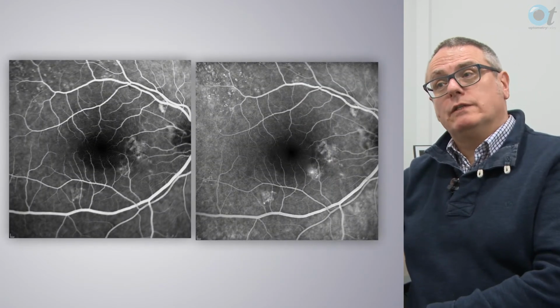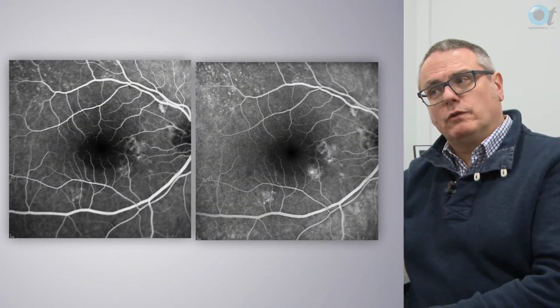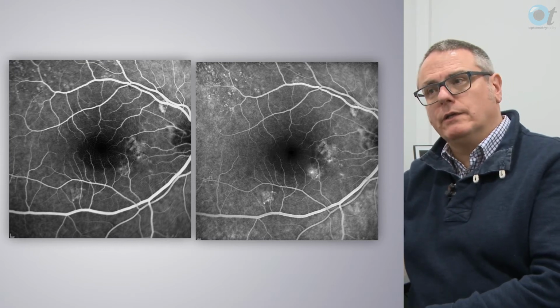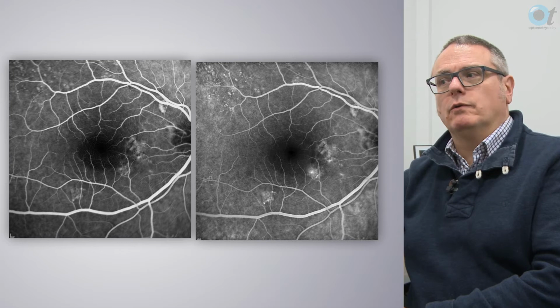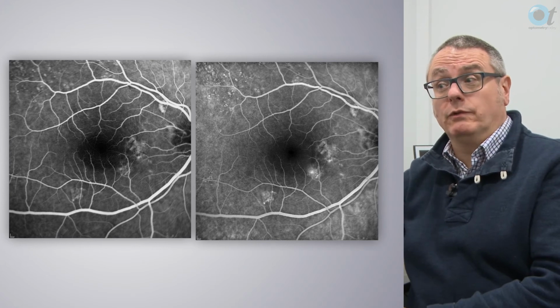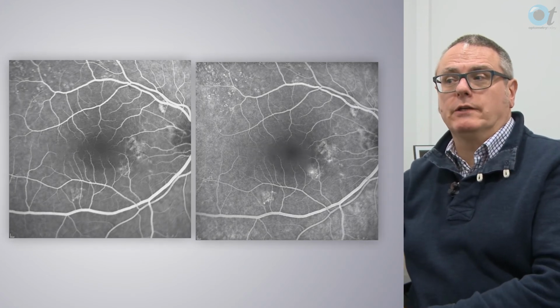Fluorescein angiography obviously is a useful investigation in terms of hospital investigation of the patient, and it allows you to identify an active area of leakage, and also identifies where the leak is if you're thinking about invasive laser therapy as a possible treatment for the patient if they've got a chronic presentation.